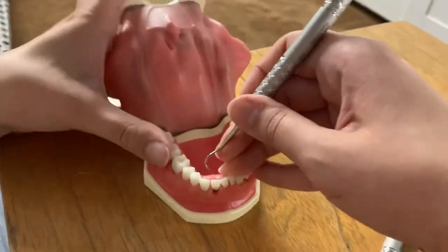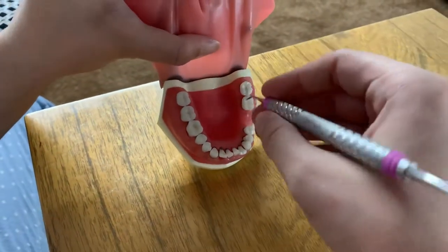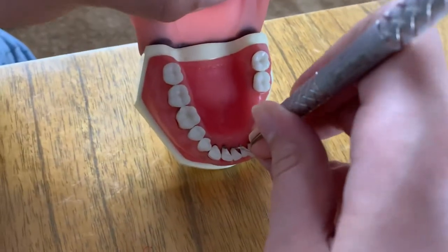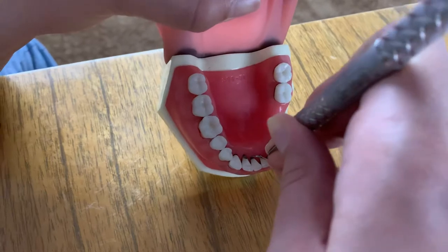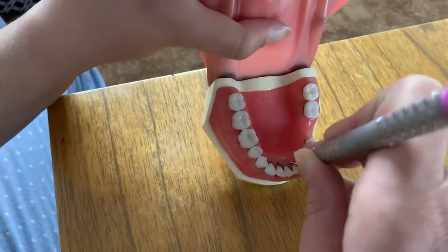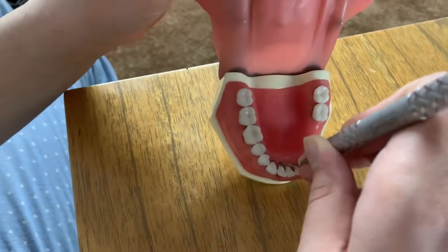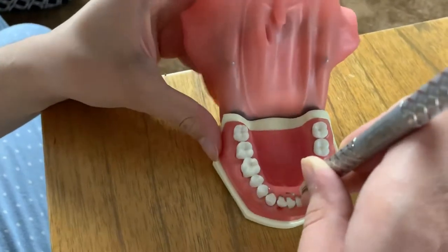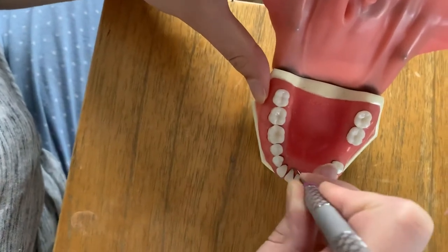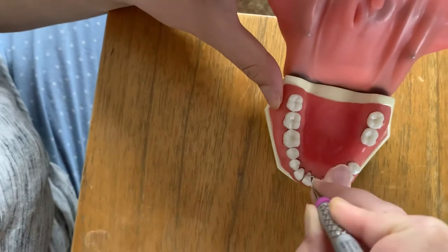I'm going to do the same thing on the lingual surfaces for the mandibular teeth. We're going to flip the instrument, find the correct working angle right there. You can see there's a lot of buildup, as there normally would be on real life teeth. We're going to start at the midline, try to stay subgingivally, and work to end up interproximally.